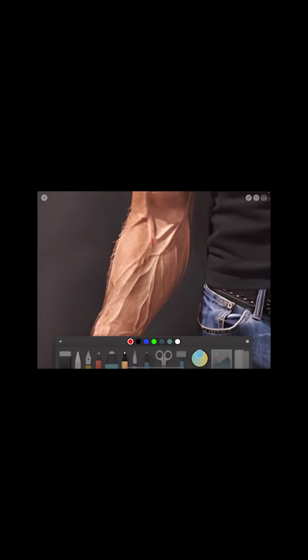You would think that this gigantic area and diameter of the vein would be great hemodilution. It probably is for this patient or this person. But remember, our patients don't have muscles this big. So, I mean, think about it. If we want to scale that, if we put a 20 gauge catheter, it's probably relatively more like this to most of our sick patients.